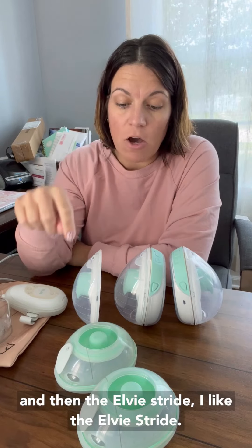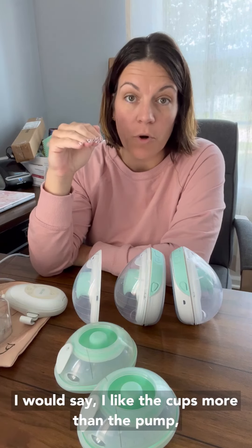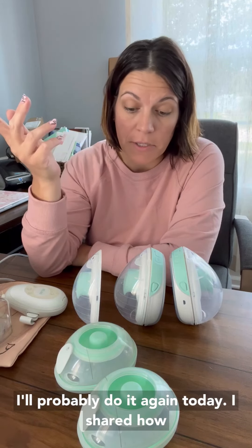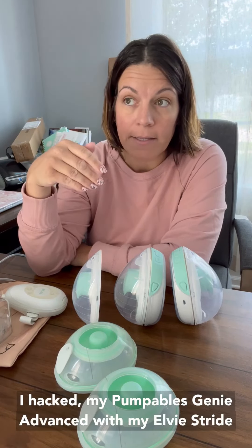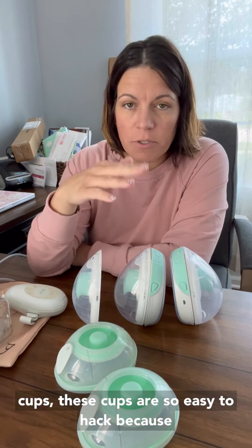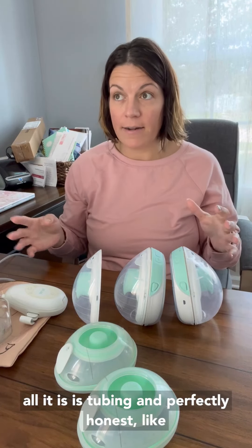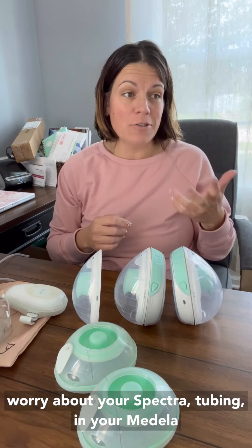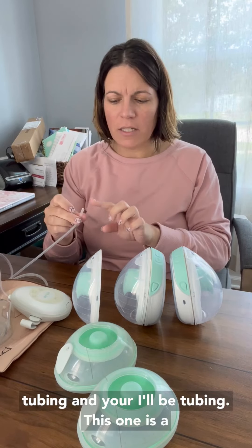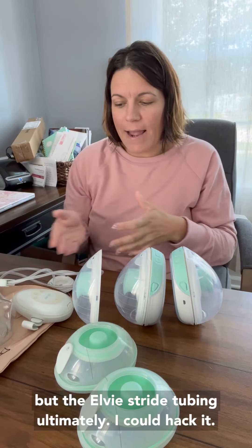And then the Elvie Stride. I like the LV Stride. I would say I like the cups more than the pump, 100%. Yesterday in my stories I shared — and I'll probably do it again today — how I hacked my Pumpables Genie Advanced with my Elvie Stride cups. These cups are so easy to hack because all it is is tubing, and tubing is universal.